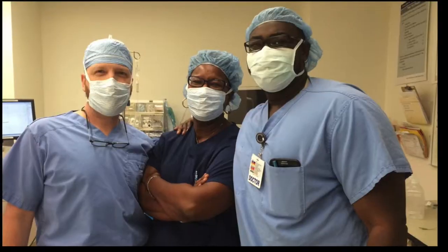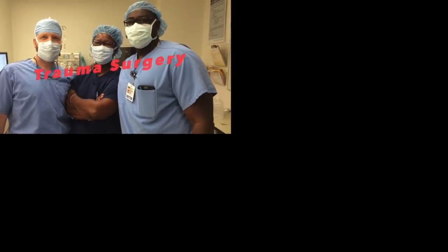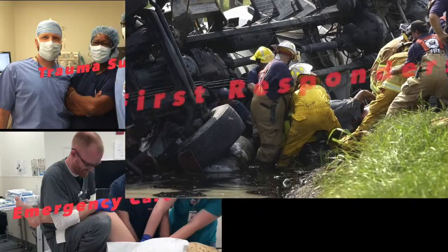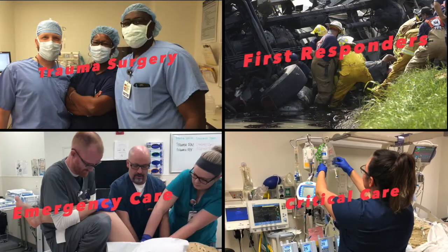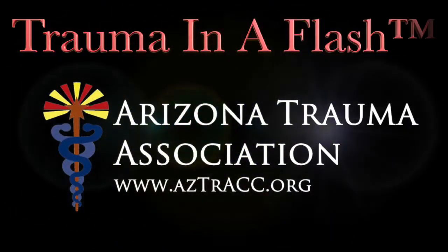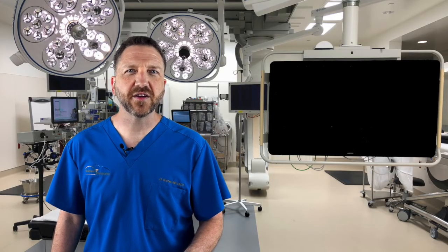Hi, I'm Dr. Joe Zucker with the Arizona Trauma Association, and this is Trauma in a Flash. Focus assessment with sonography for trauma, also known by its acronym FAST, is a widely used tool for the rapid evaluation of patients with blunt and penetrating trauma.